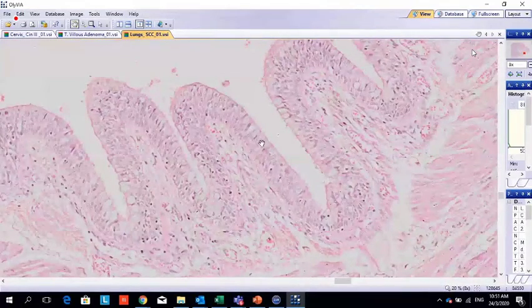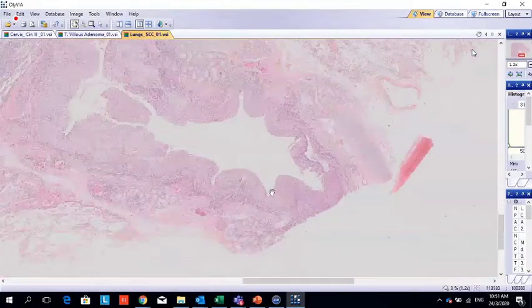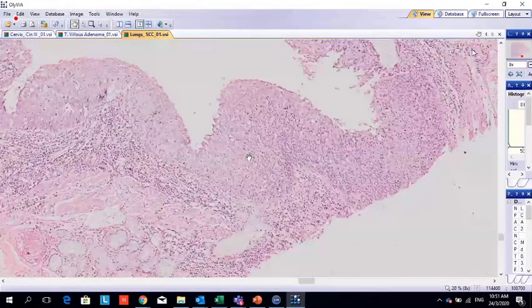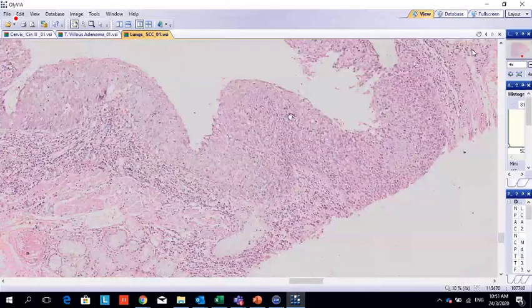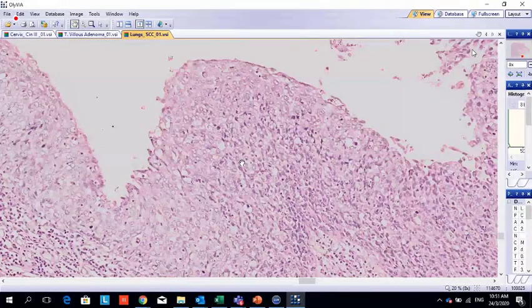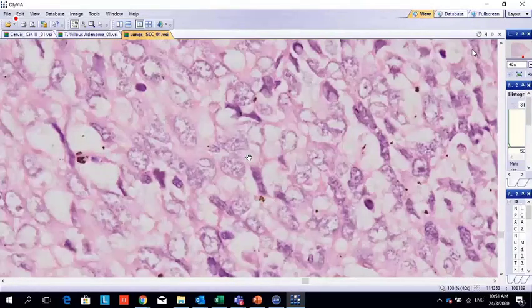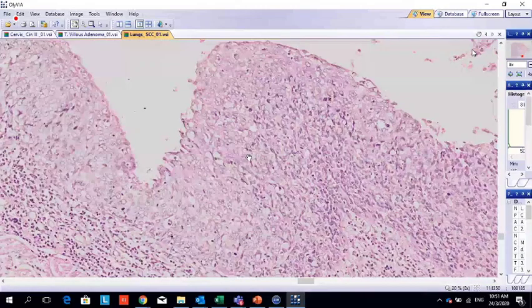This bronchus, okay, with this one. Is there any columnar lining? No. It became squamous. Yes, very good. Metaplasia. Metaplasia plus, is it normal squamous? No. What happened? Dysplastic squamous. Yeah, dysplastic. See, actually, first there is metaplasia; it becomes squamous.